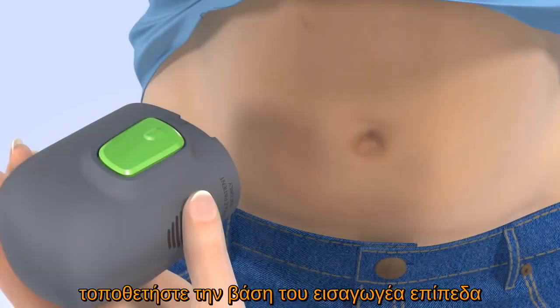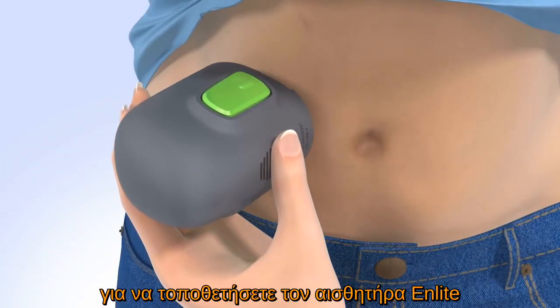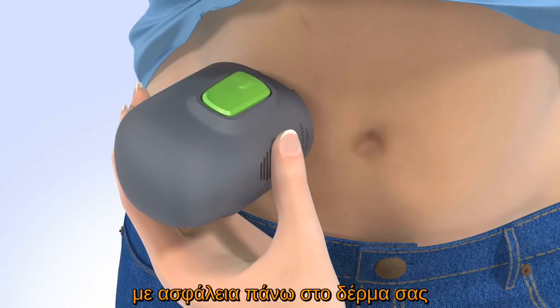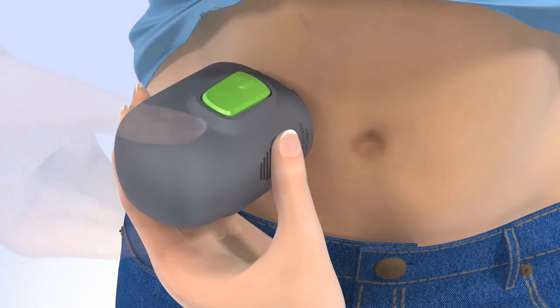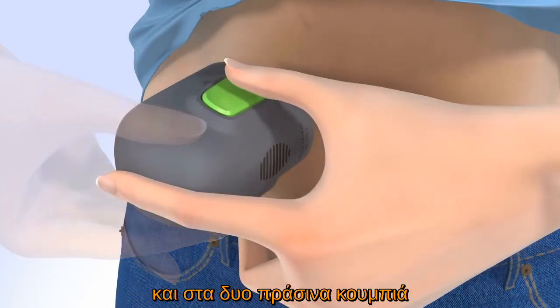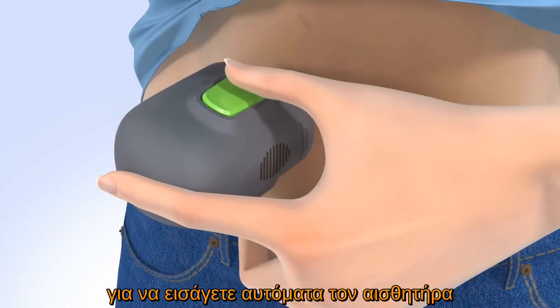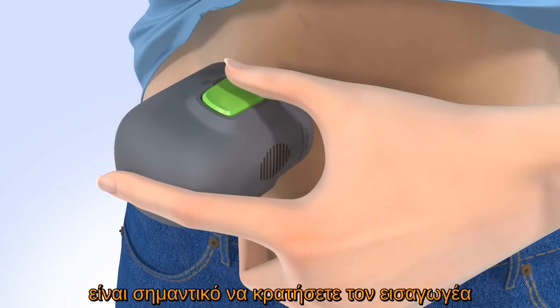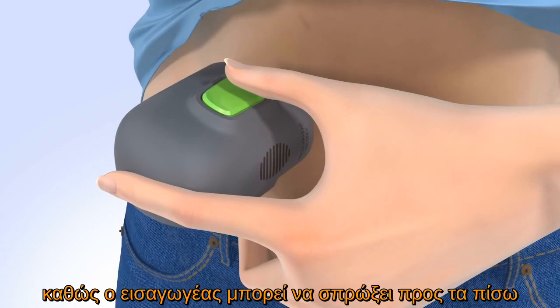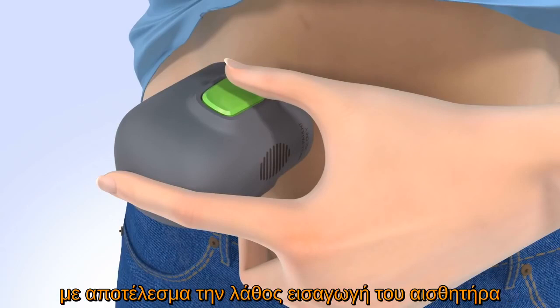Place the base of the Sertor flat against the site that you prepared. To insert the N-Lite sensor, be sure you are holding the Sertor securely against your skin without pushing it in too deeply. Press and release the small bump on both green buttons at the same time to automatically insert the sensor. It is important you hold the Sertor securely against your body while you do this step, as the Sertor may spring back after pressing the buttons, resulting in improper insertion of the sensor.